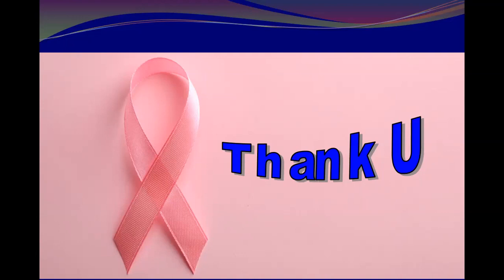And regarding the fibrous ridge, you can see it anywhere in the breast. What is the fibrous ridge? You have now seen two examples of fibrous ridge. It can be sharp, the parenchyma sharply tenting, or it can be humping, or a focal area of fibrosis like this.